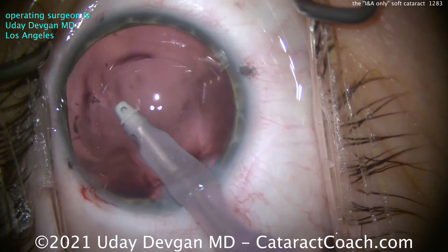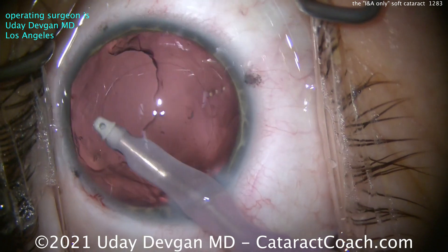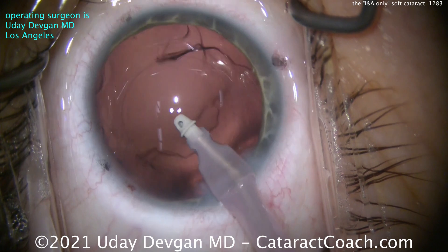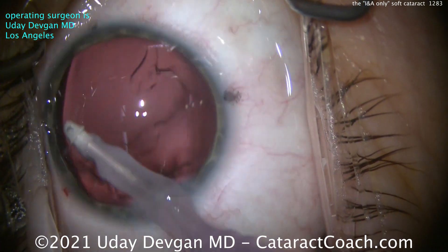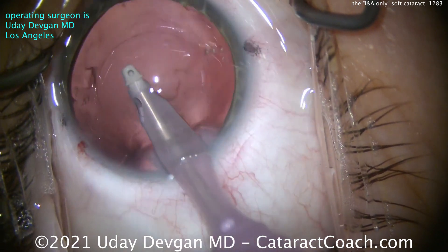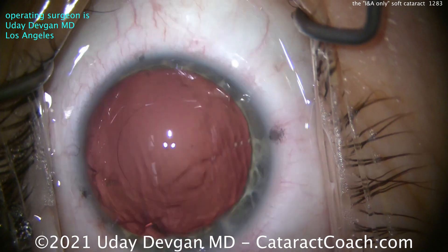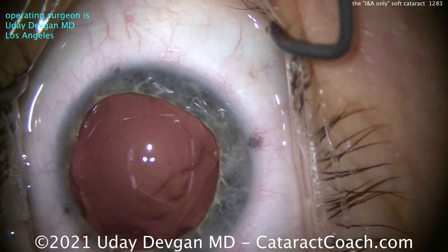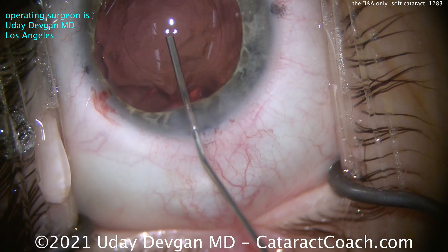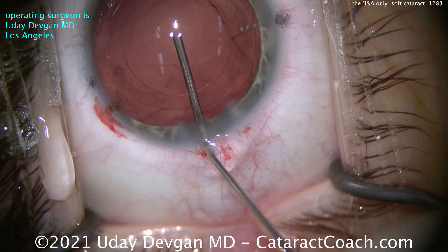PCO is much more common the younger you are. In fact, if you operate on little tiny kids — babies — the PCO rate is 100%, for sure, within the first year, even the first few months. This is why in the baby case we do a posterior capsulorrhexis or even an anterior vitrectomy primarily, intentionally, on those congenital cataract cases. So on a patient who's 30, obviously that's not the same as pediatric — 30 is an adult — but still, the rate of PCO in a 30-year-old having cataract surgery is much higher than the rate of PCO in a 70- or 80-year-old.